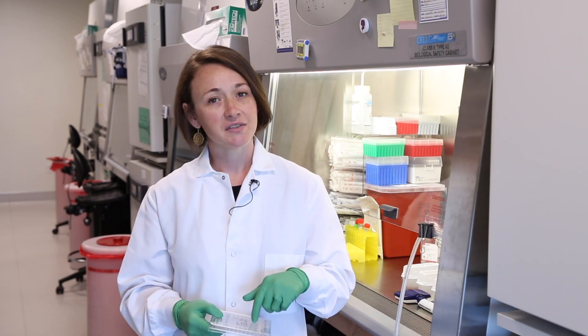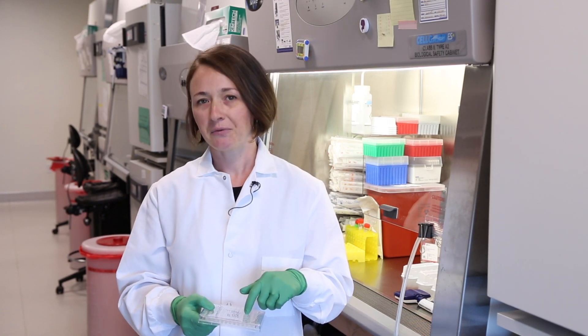Hi, I'm Amanda Haupt. I'm a research associate here at the Allen Institute for Cell Science, and today I'm going to show you how we cryopreserve our clonal human-induced pluripotent stem cell lines in 96-well format, and then also how we recover these clones later by thawing them into 24-well plates.